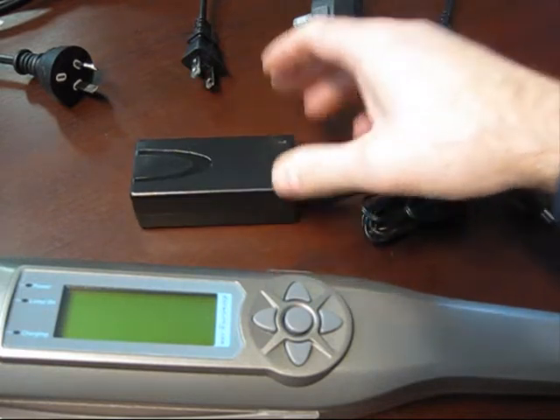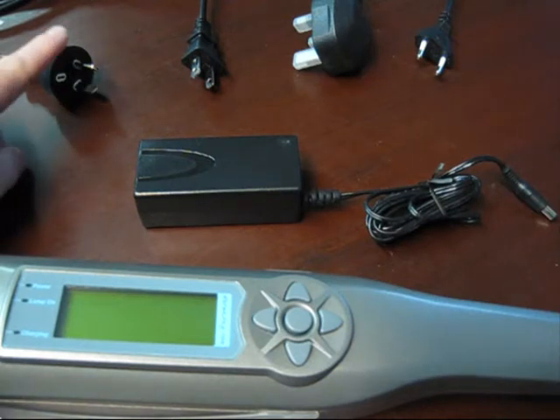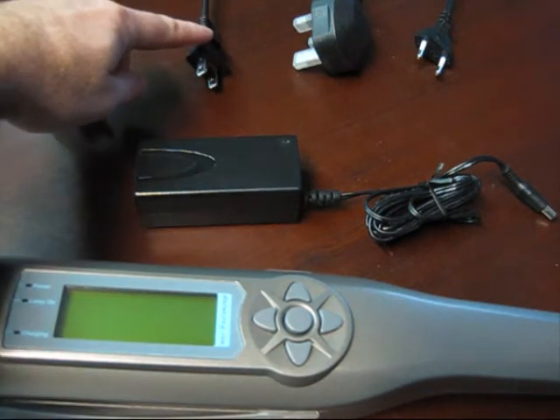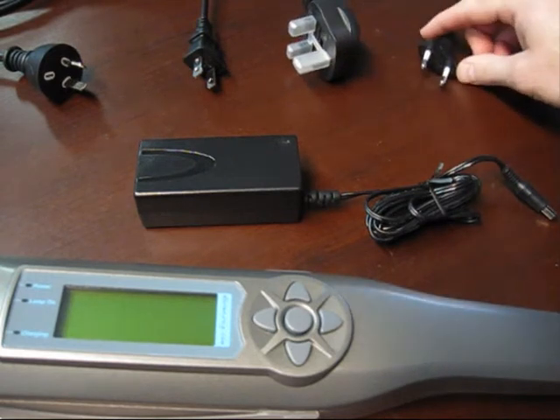You need to connect the transformer to the mains power cord. We supply one of four different cords: the Australian, New Zealand and Chinese type power cord; a 2-pin American or 110 volt power cord; the 3-pin UK and Malaysian type power cord; or the European 2-pin round socket.